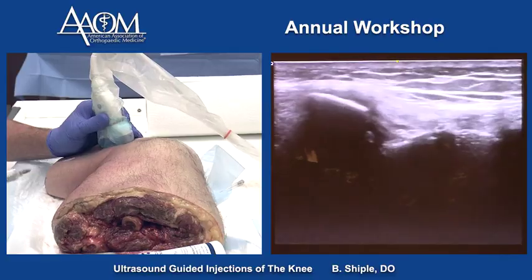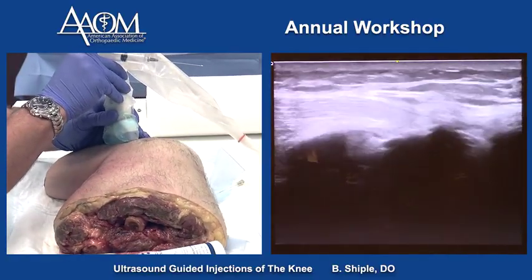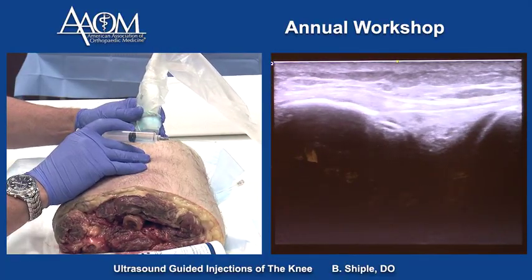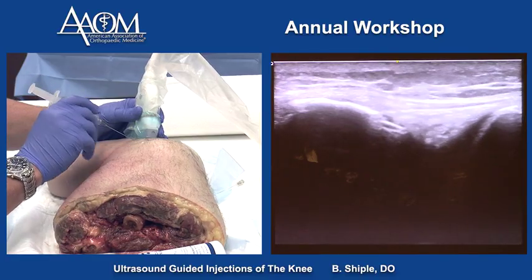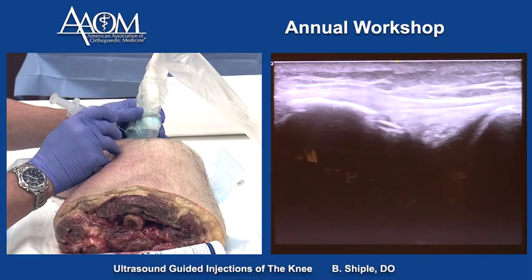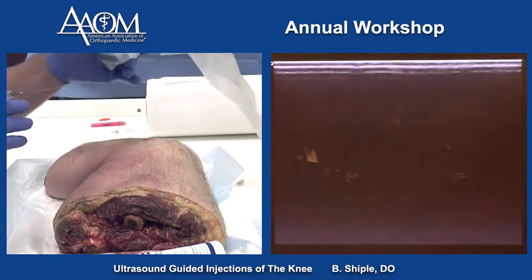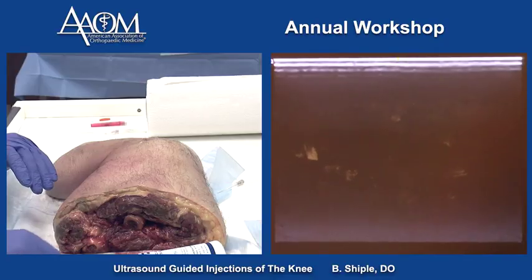The only other area we haven't shown is the IT band insertion — that's a good shot of the IT band. We can inject it short axis or long axis. That's the short axis technique at the insertion area, and it is a very effective treatment technique. Next section will be the medial aspect of the knee.